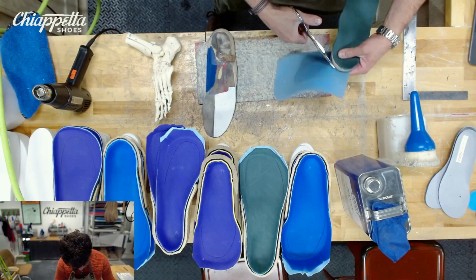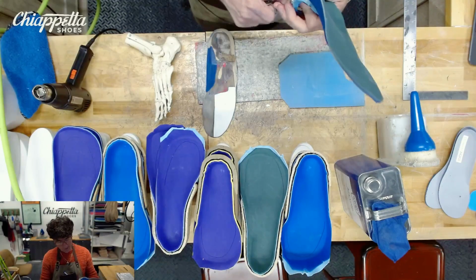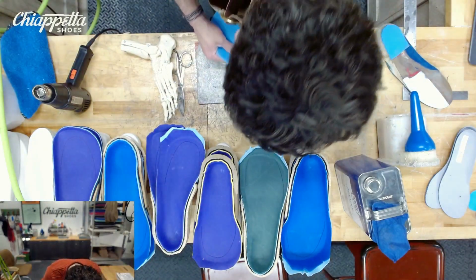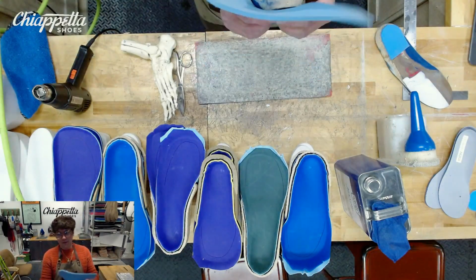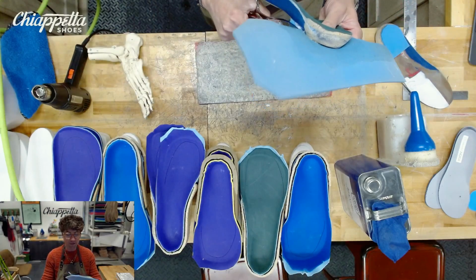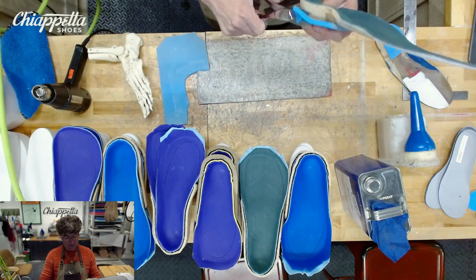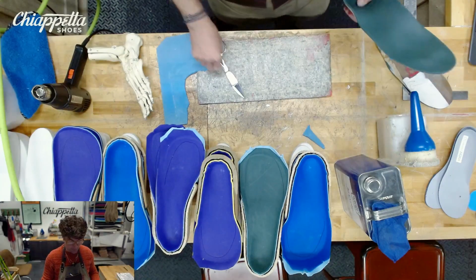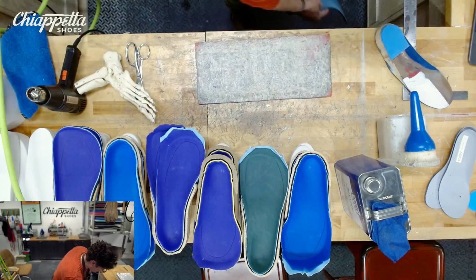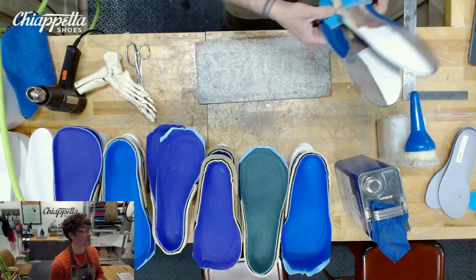And sometimes a little extra heel height, for all of you drop experts out there, you think you know everything. A lot of you don't. Elevation and heel height creates instability within the ankle. I understand that. I know that. And we are looking at all of the different things we've tried so far. And I think that a little extra heel height is going to help stabilize the foot. When we get into the 1/4 inch, 1/2 inch functional heel heights, in addition to standard, that's when we're talking about some more of a correction. So we're going to take this to the grinder, taper it up real quick, and then get you rolling.